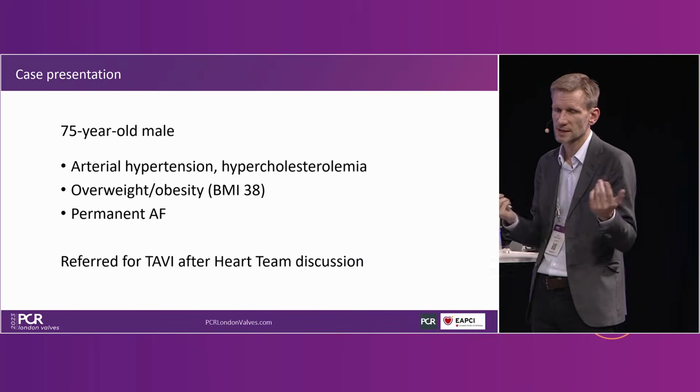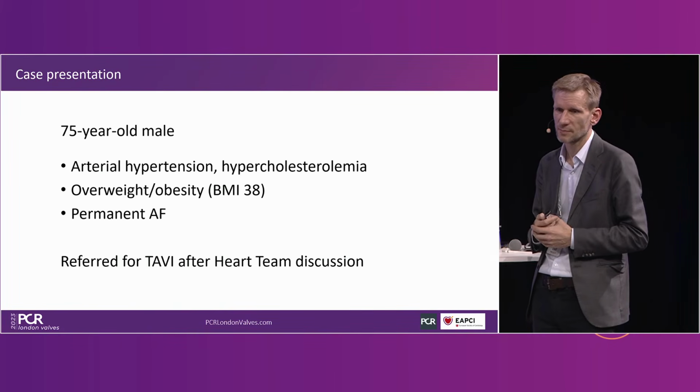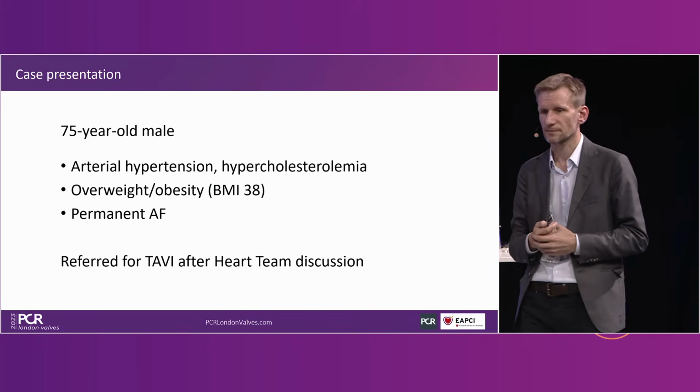Yes, that's it. I think we have really only 10 minutes. I want to show you this case still. So, a 75-year-old patient, also treated 2 weeks ago. Hypertension, hypercholesterolemia, obesity, BMI 38, and permanent AF, referred for TAVI.